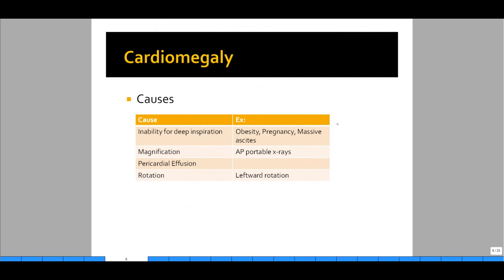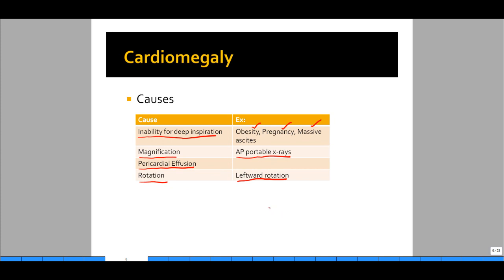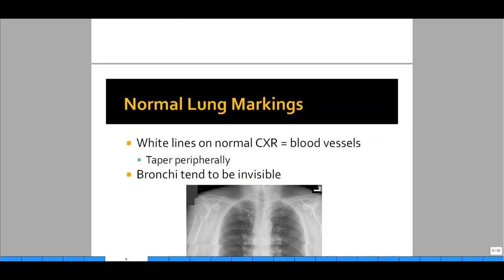What are the causes of cardiomegaly? There are true and false causes. A false cause is the inability of the patient to take a deep breath, commonly occurring in patients who are obese, pregnant, or have massive ascites. These conditions put pressure on the thoracic cavity, preventing a deep breath, causing the heart to appear crowded and larger than it should be. Magnification from portable x-rays can also produce false cardiomegaly. Pericardial effusions can mask the border of the cardiac silhouette, making it appear larger. And leftward rotation changes the way you're looking at the heart, which could also cause false cardiomegaly.